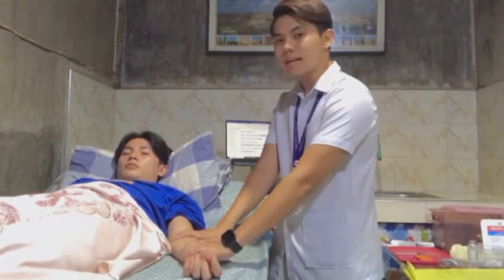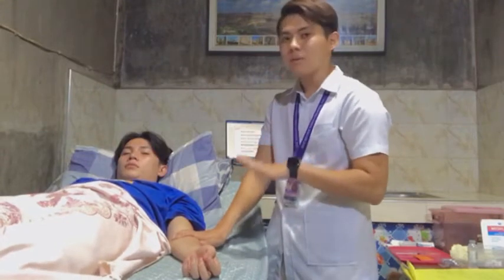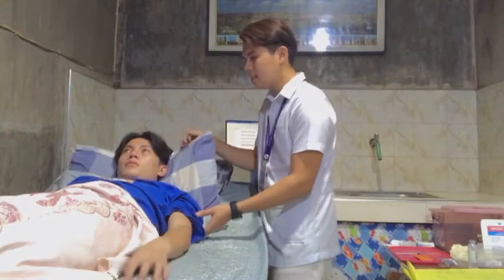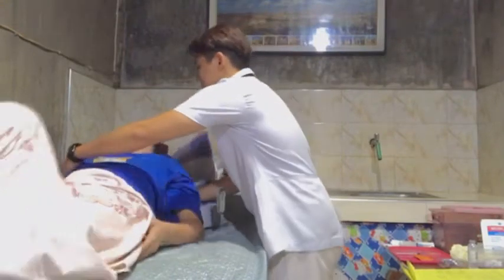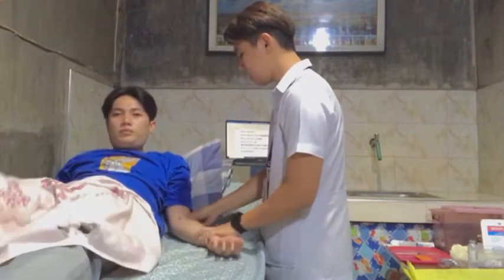Of course, next we need to position the patient's arm so that his elbow and forearm will be supported on a flat surface. Okay, Sir Miles, can you please adjust, please? Okay, and then just bring your hand here, sir.